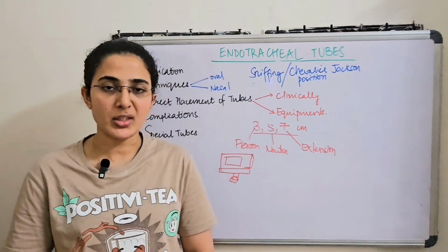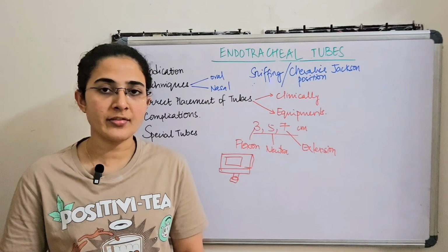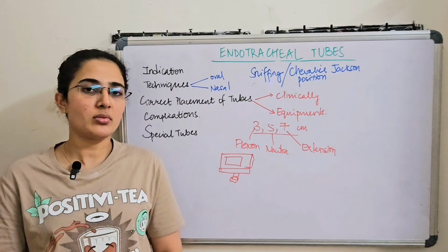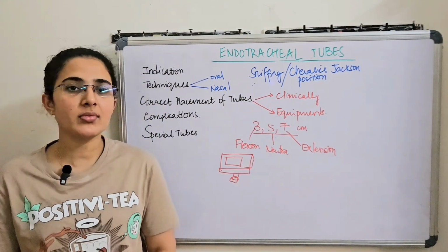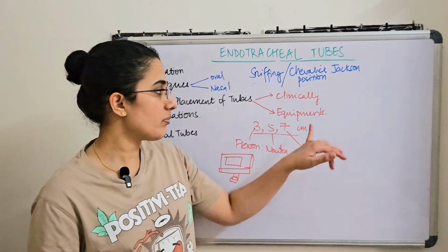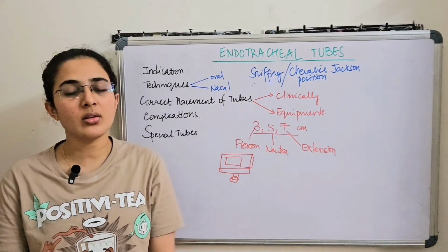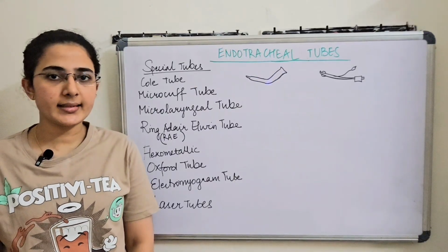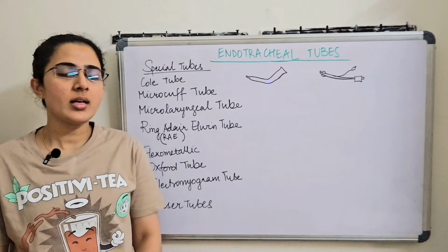Then we see the pressure volume loops. The pressure volume loops will not come if it is an esophageal intubation, but they will be present in case of an endotracheal intubation. Also in EtCO2, we see that certain different waveforms will be present if it is an endobronchial intubation. One of the latest equipment which will help us differentiate if it is an esophageal intubation or not is ultrasound.